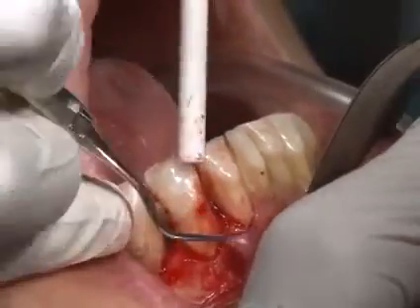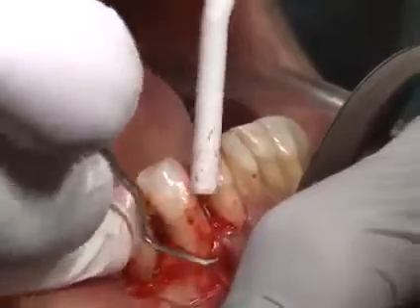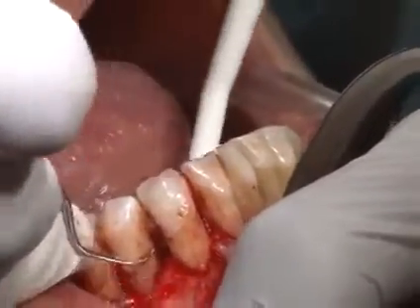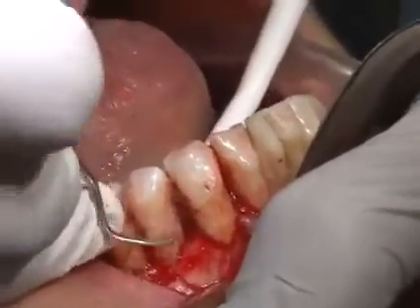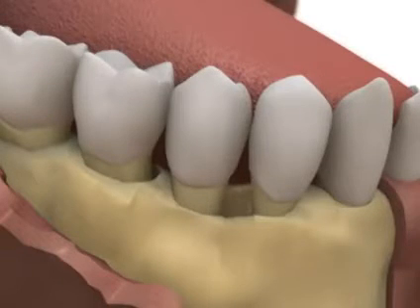Thorough scaling and root planing is extremely important. All subgingival plaque and calculus must be removed with hand curettes and ultrasonic instruments to achieve a root surface that is physiologically acceptable. Next, the extent and configuration of the osseous defects are determined.